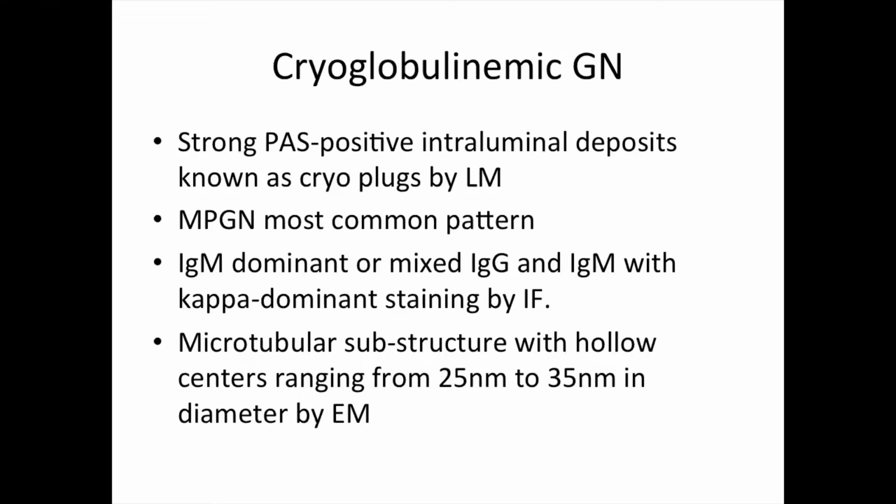طبعا the diagnosis of cryo is predominantly based on, and this is what the experts say, identifying the substructures في electron microscopy.